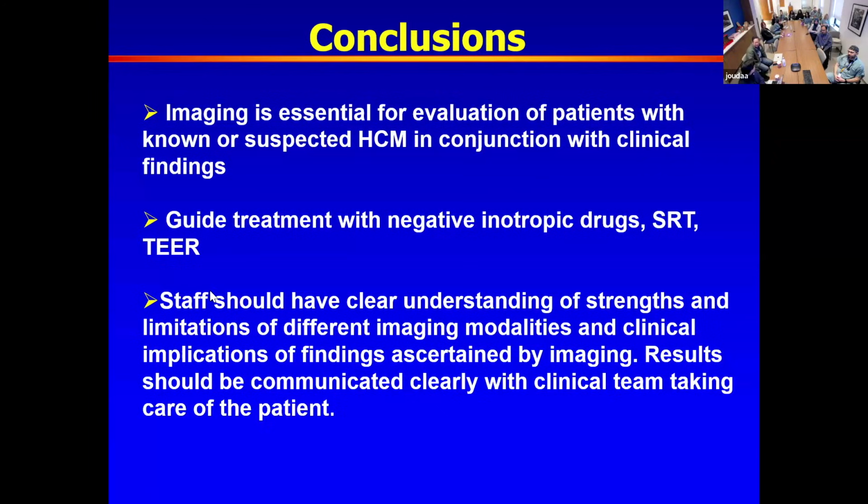I think we've done that a few times. Not often. Do you still use amyl nitrite in the US? Some labs do. In our lab, we do not use amyl nitrite. It's a matter of practice as far as the Valsalva, I would say. If I do it on every case that comes to the lab with that diagnosis, I will get better at it.